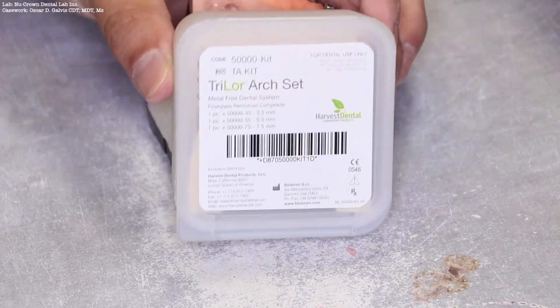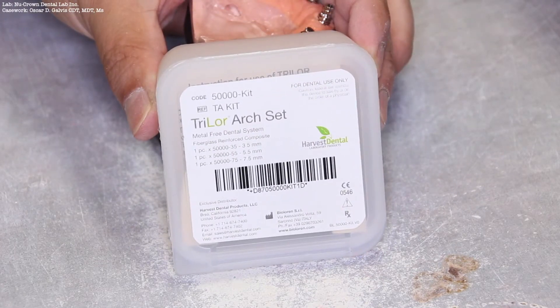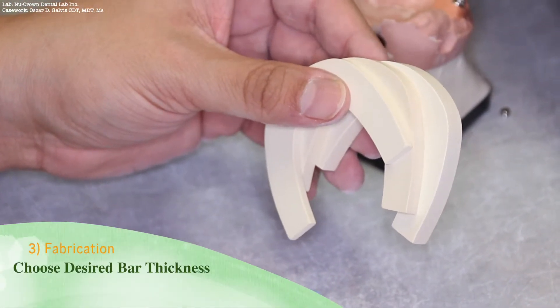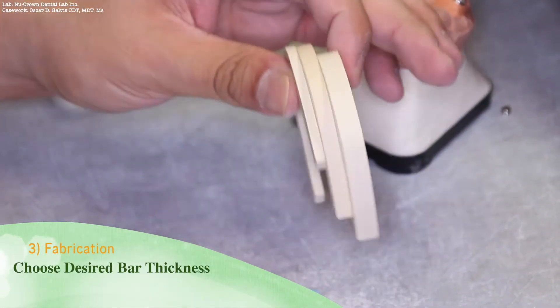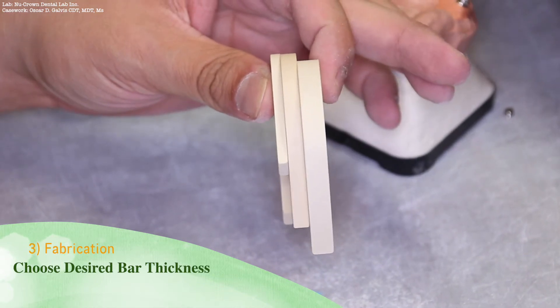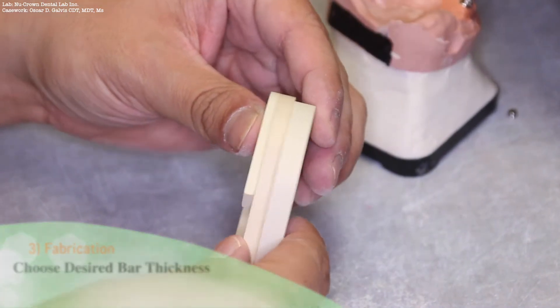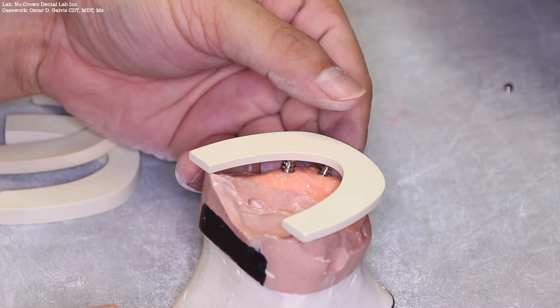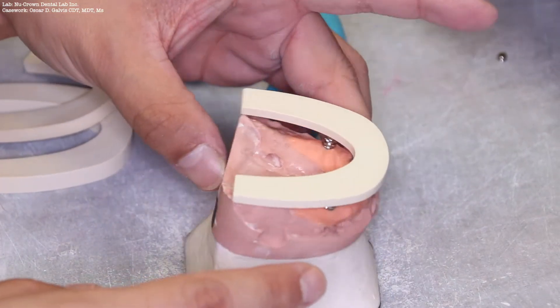We are now ready to open up the Trilor arch set. Within this arch set, there are three different thicknesses for different types of substructures. Choose the desired thickness for the substructure. The substructure thickness desired here is 3.5 millimeters.